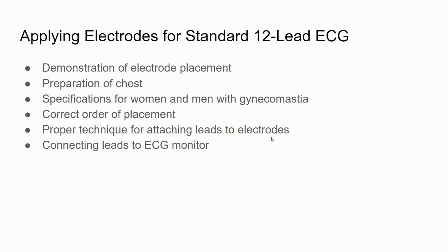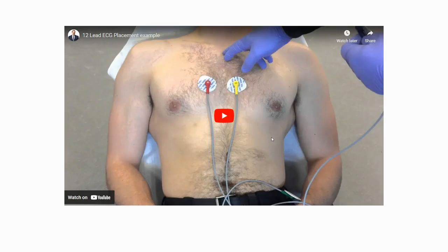So here we'll show you a couple of videos on ECG placement. This is a teacher in a school in Ontario. He has a slightly different way of landmarking or finding his landmarks. I won't lie, this is the way I used to do it too, but definitely stick with the way of the sternal notch, angle of Louis, then moving to the right. And then once you get more adept at finding these landmarks, well, then you can use this technique. But nonetheless, I just wanted to show you a video, since we're not live in class, of how to place the electrodes.